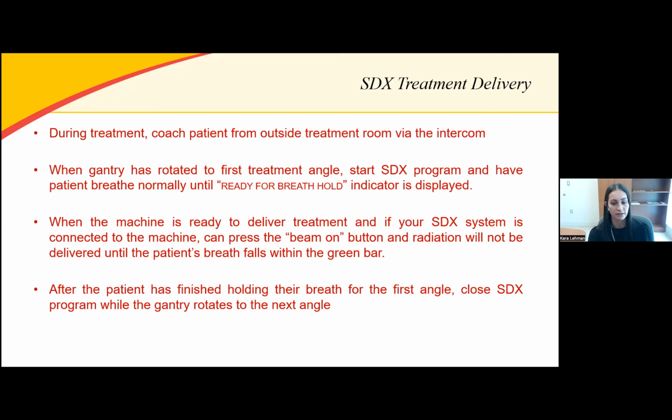So if they want to break their beam up into 2 breaths, they can wait until you, as the therapist, tell them that they're at 50%, or if you tell them they're at 90%, maybe they'll just try to continue to hold their breath a little bit longer. Otherwise, they don't really know how much beam is left to deliver. So I would just recommend communicating to the patient during treatment and letting them know so that they can decide how quickly or how long they want their treatment to take.